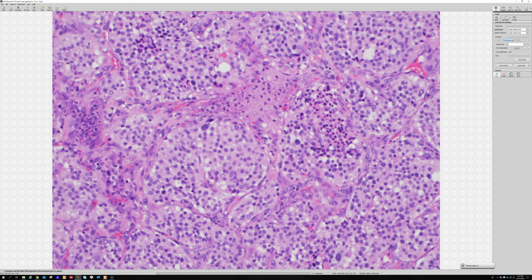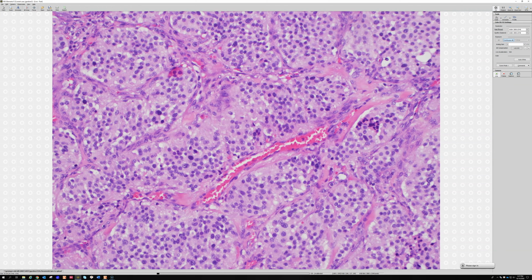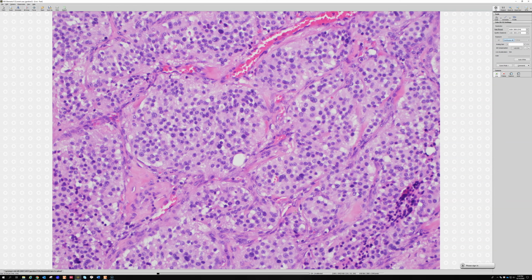It's like any type of neuroendocrine marker. Yeah, synaptophysin and chromogranin will be positive. And then an interesting thing, if you do S100, a lot of times you'll get scattered S100 positive cells around the outside of each of these nests or Zellballen packets, and those are called sustentacular cells.